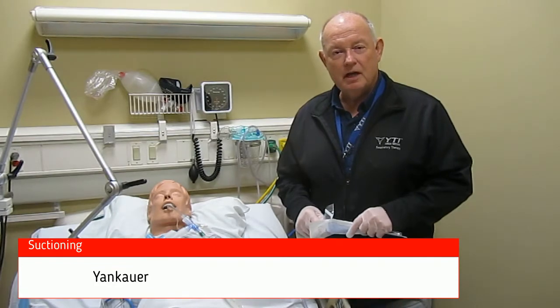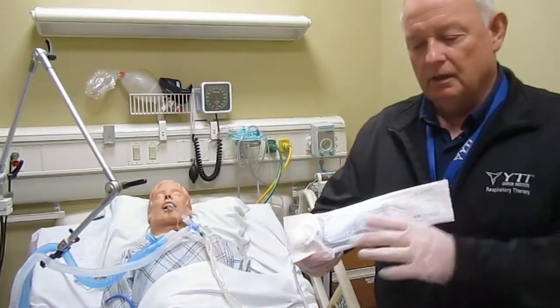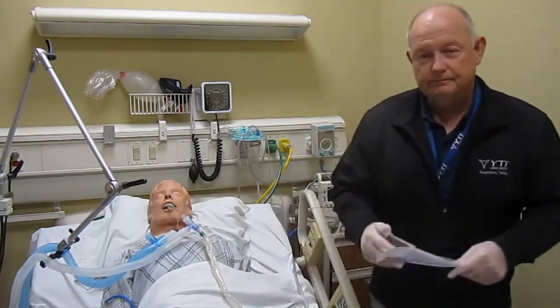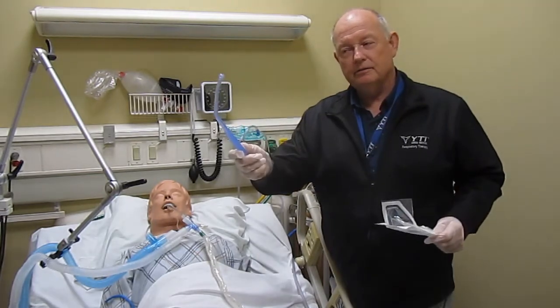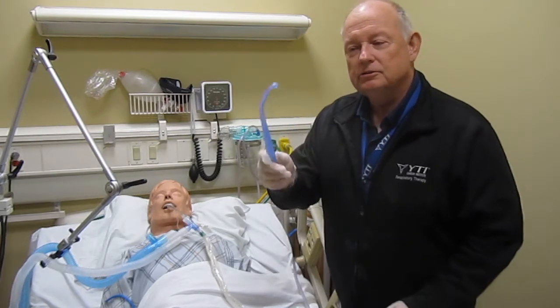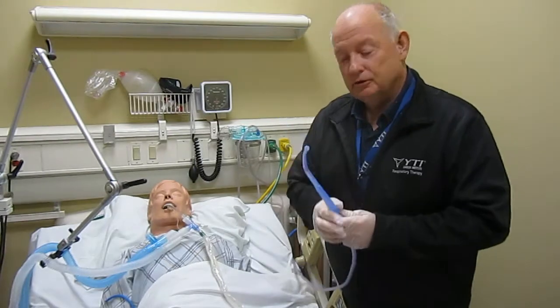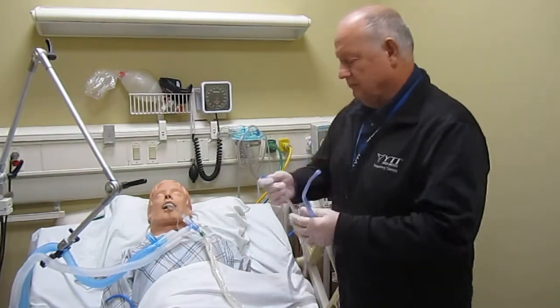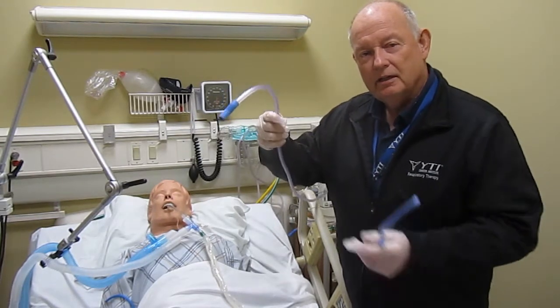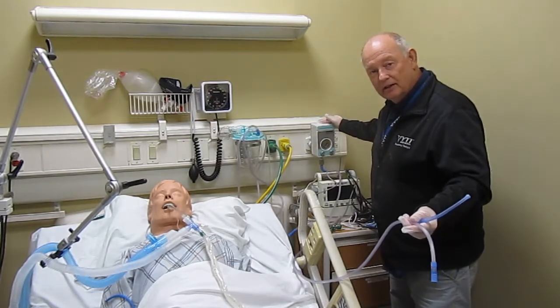Suctioning with a Yankauer. This is a Yankauer. It looks like this. It is also called a tonsil suction, or sometimes a tonsil tube. It connects to the suction tubing. The suction tubing runs to the suction regulator.